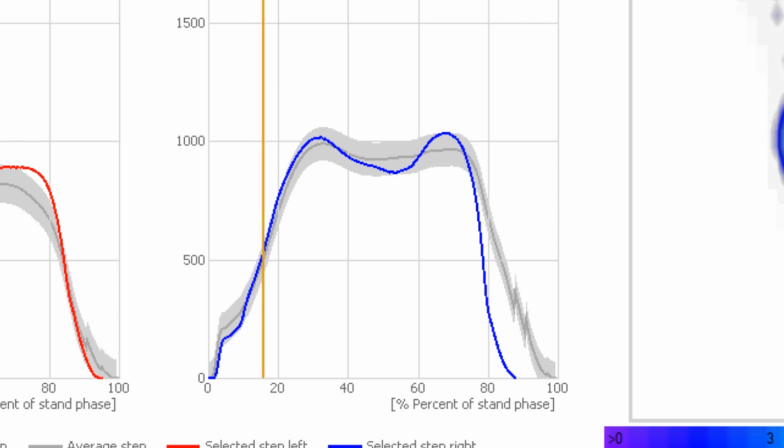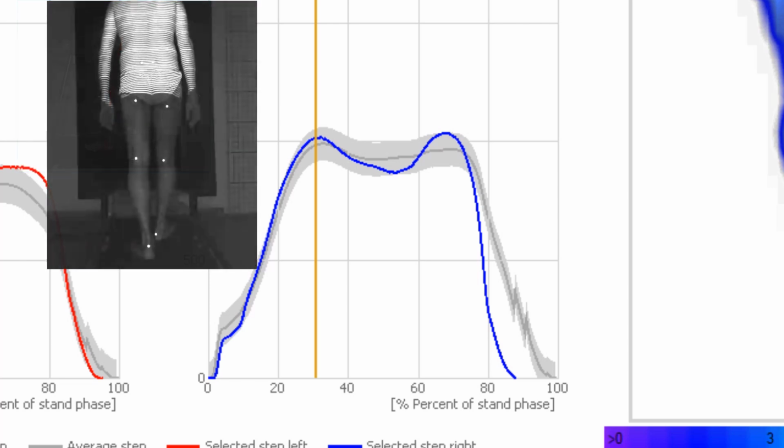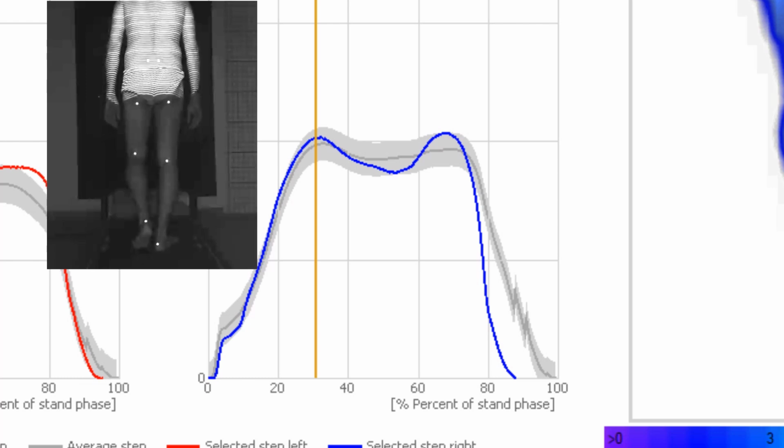Increasing load creates torques in the joints that are controlled primarily by eccentric muscle activity of dorsiflexors as well as knee and hip extensors in the sagittal, hip abductors in the frontal, and knee external rotators in the transversal. This is the central functional task in the so-called loading response, the phase we are currently in. The moment of maximum force is also the moment of maximum eccentric demands on the structures mentioned. A multitude of gait deviations become visible here.